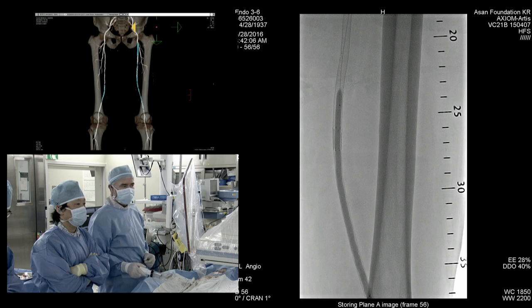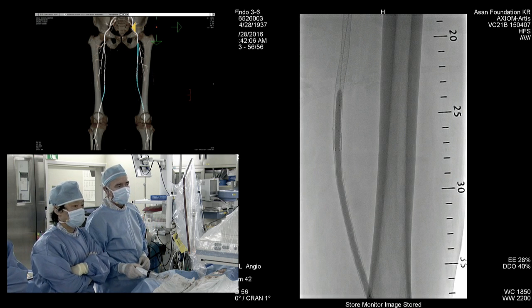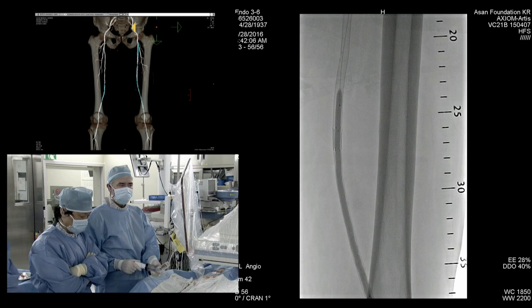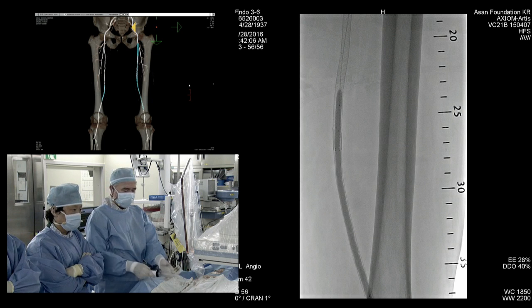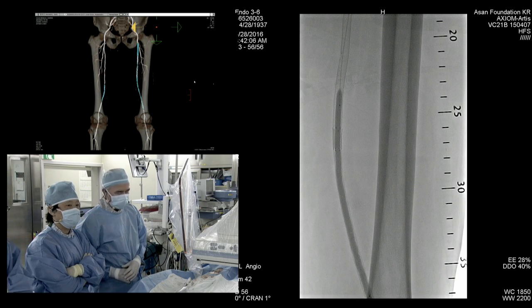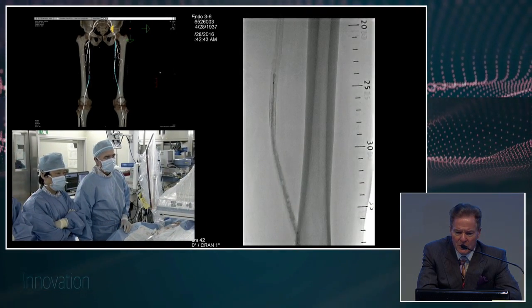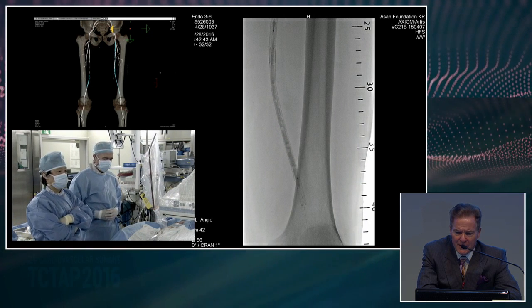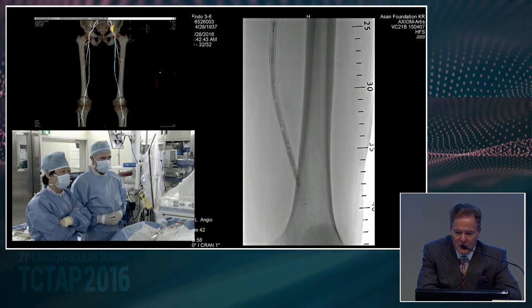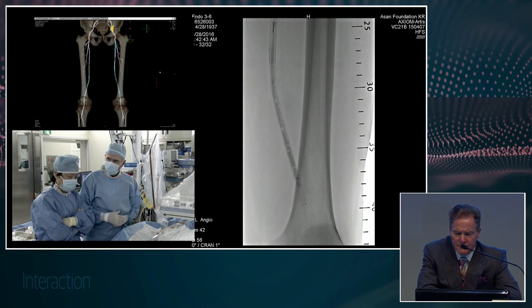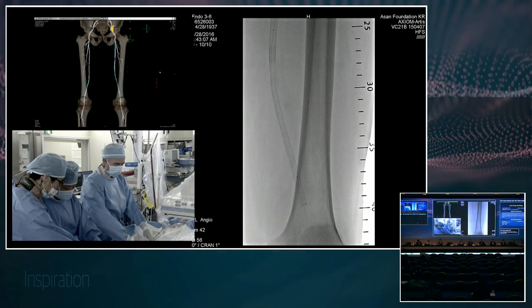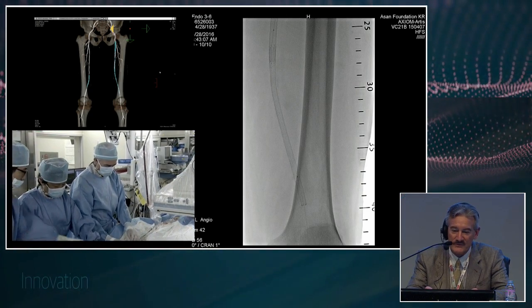We went up to about 10 atmospheres in both inflations with a nice full balloon. The only question after we take this angiogram is whether we need to extend our DCB beyond the stent into the popliteal artery. We're always worried about economically practicing evidence-based medicine. It would be nice to have scored balloons with drug-eluting technology. With ISR, there's frequently bulky hyperplasia that can dissect or migrate, so vessel prep before applying a DCB is very important.